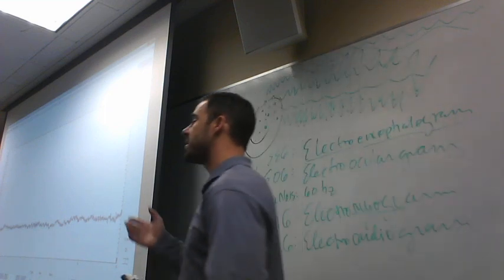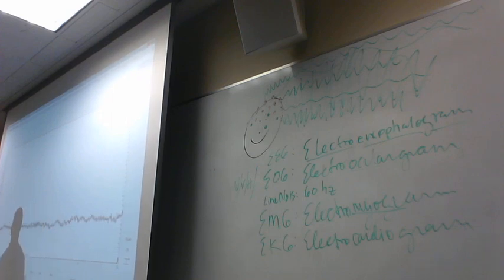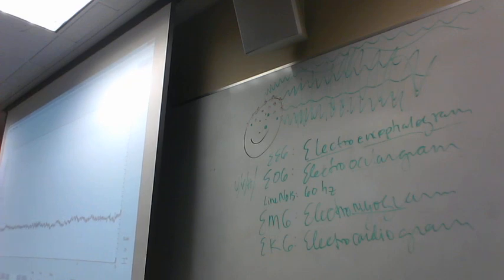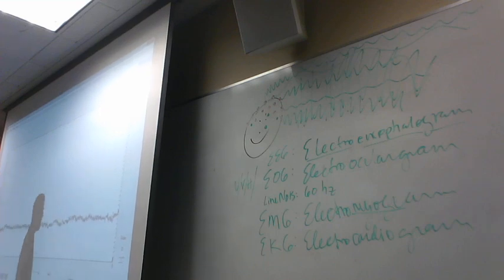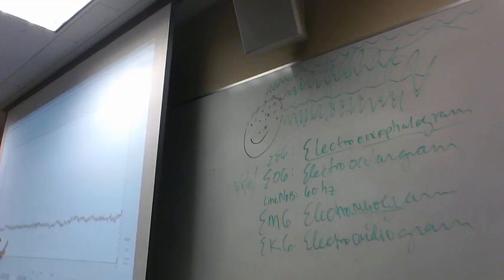Okay, so that's in an EEG, and that's different than an ERP. What an ERP is, on the other hand, is, let's say that, oh, this is really nice actually. So we have 1, 2, 3, 4, and I guess a 5. Let's pretend that every time there's a number here, it represents something on the screen that you either remembered or forgot. Okay? And so what we want to do is we want to average activity for each of these epochs.